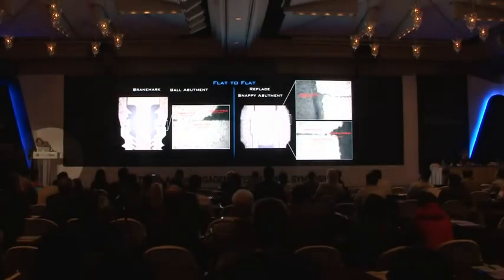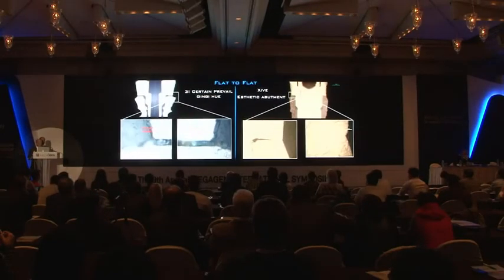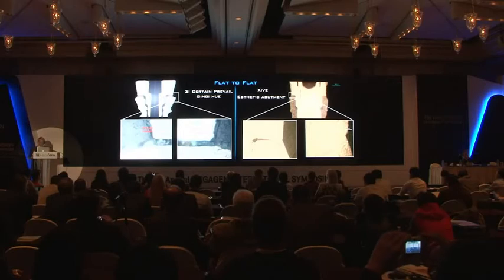These are the optical images from flat-to-flat connections: a Brånemark system, a Replace system. You can see how big the microgap is in this case. Also in 3i, the microgap is large. The best of the flat-to-flat is the Xi, because it has a bevel in the implant abutment connection.